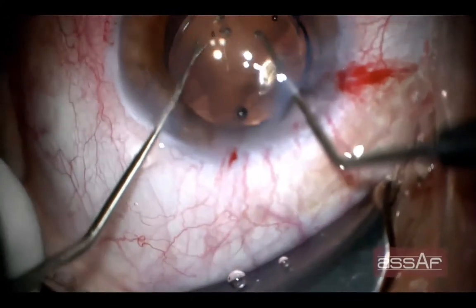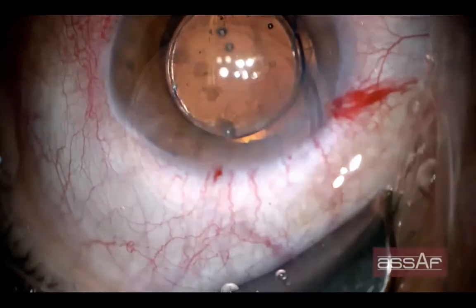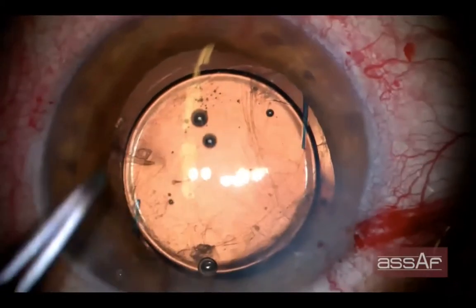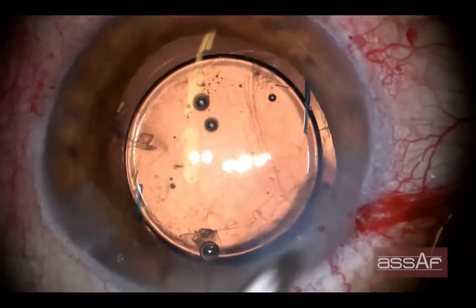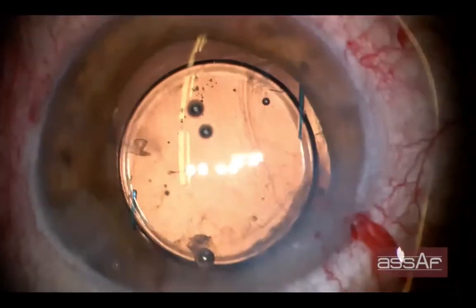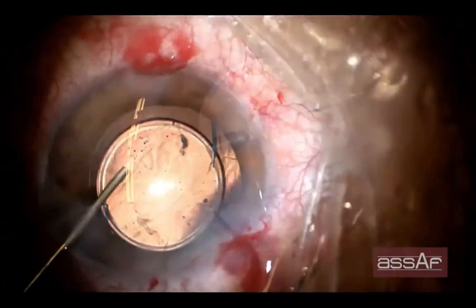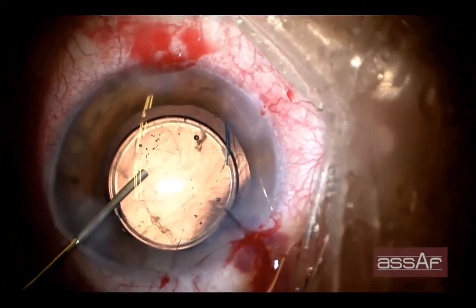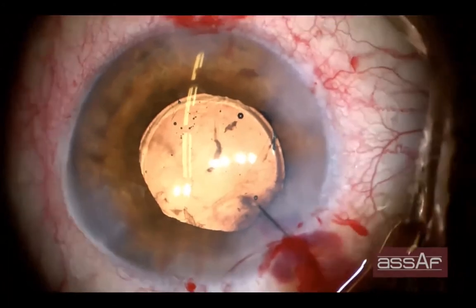By keeping the optic of the three-piece lens within the lens bag, we can assume a good centration of the lens, and the optic now is within the capsular bag while the haptics are in the sulcus. As you can see, the lens is pretty well centered despite the area of mild to moderate lens subluxation. Now we can do some cortical cleanup and injection of acetylcholine to bring the pupil down.